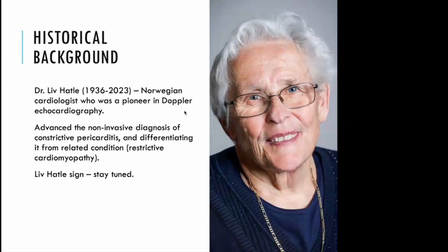Giving some historical background, this lady over here is Dr. Liv Hatle, who's a Norwegian cardiologist, who was a pioneer in Doppler echocardiography, lived between 1936 and 2023, so really only passed away a couple of years ago. She was heavily involved in the advancement of non-invasive diagnosis of constrictive pericarditis, and specifically differentiating it from related conditions, mainly restrictive cardiomyopathy. Of course, she'll have her own sign when it comes to this diagnosis, but you'll have to stay tuned for that.